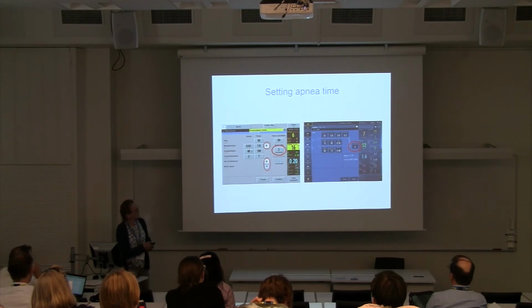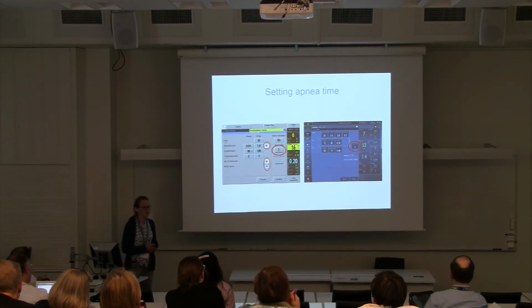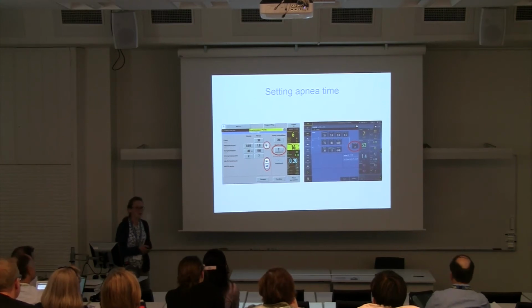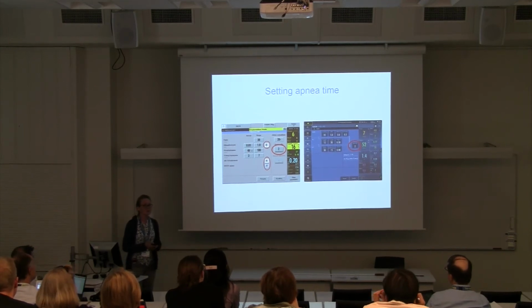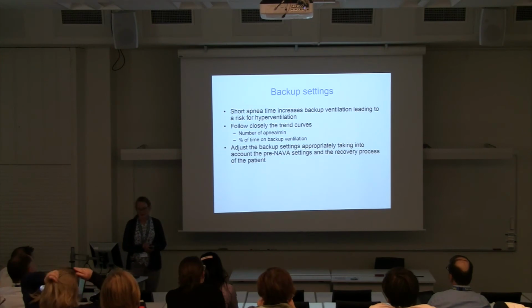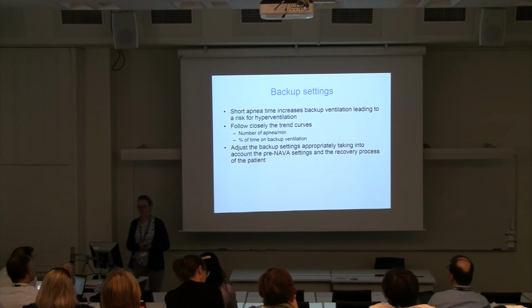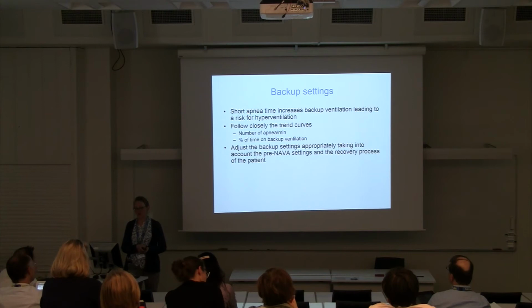So here for these both infants, we chose to have an apnea time of 2 seconds. And here you can also see that we take off all the alarms from the ventilator so that the baby and the family don't get disturbed by any alarms. So the shorter the apnea time is, the higher the risk for hyperventilation.